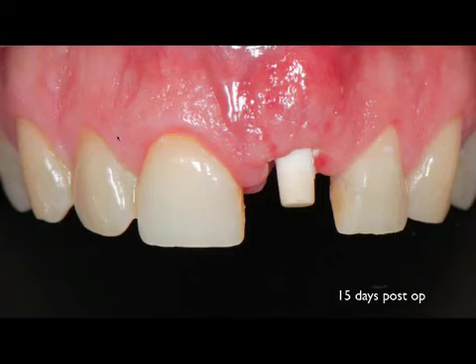Most of these cases do not require preparation of the zirconia abutment. If it is necessary, we use a red diamond with copious water irrigation, and we're able to prepare the abutment. We try to keep that preparation to a minimum.